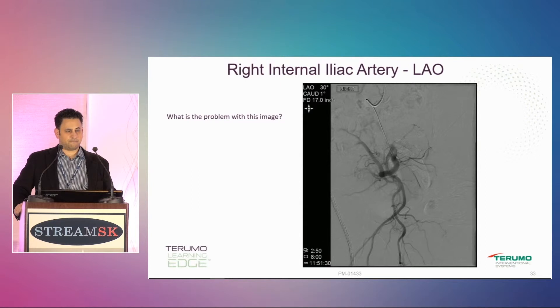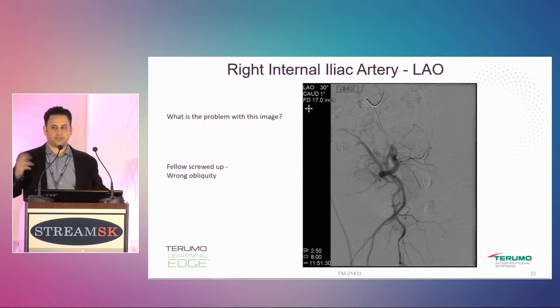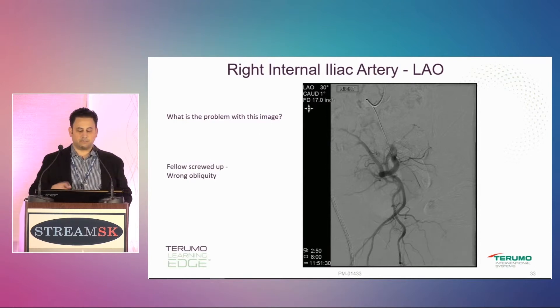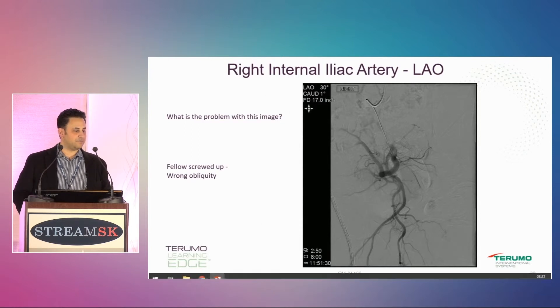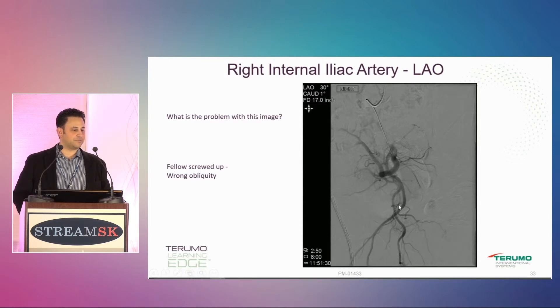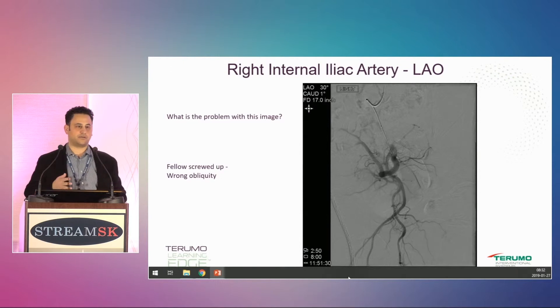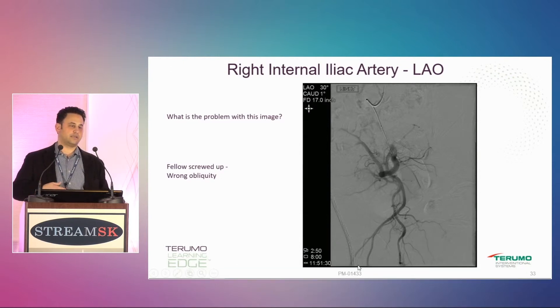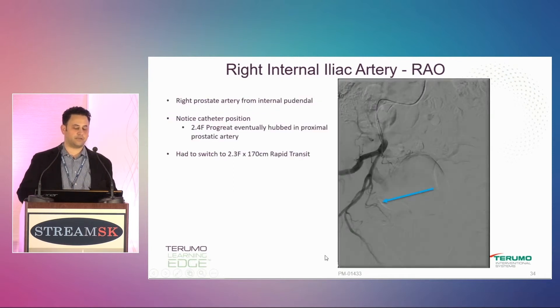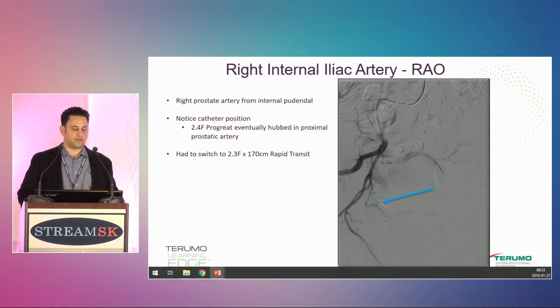The injection on the right side — does anyone know what the problem with this one is? My fellow used the wrong obliquity; this was actually a contralateral oblique of the right. Oddly enough, you can still see the prostate artery origin pretty well on this obliquity. It's great for splaying out the anterior and posterior divisions, but not necessarily great for showing the prostate origin. It worked out not badly, but we still repeated it in the ipsilateral oblique, and here you can again see the prostate artery.